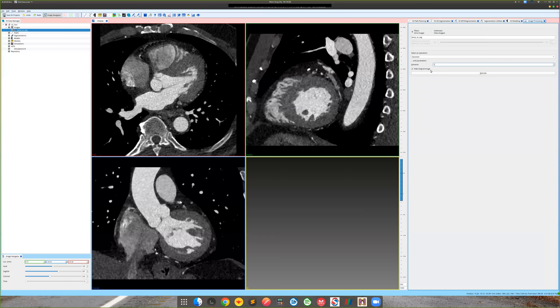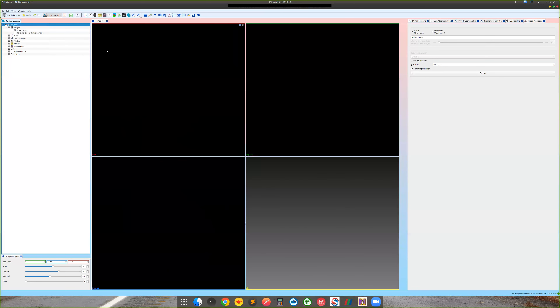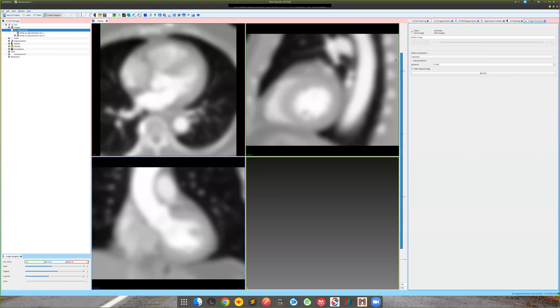By default it hides the original image, and the whole image seems to vanish. The reason is the variance is so high it's covering almost the entire domain. Let's lower the variance and redo the process. This is also probably too high — let's lower it further. I think the value that works for this is probably 0.005.